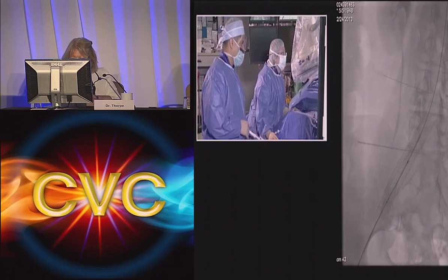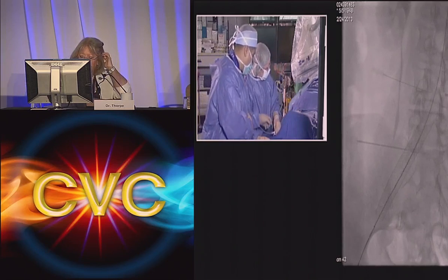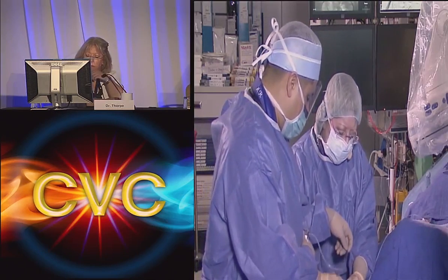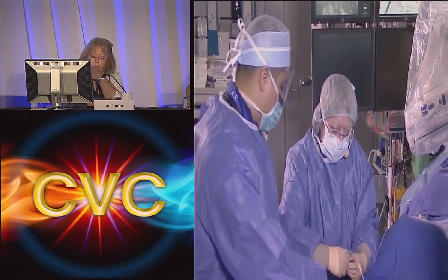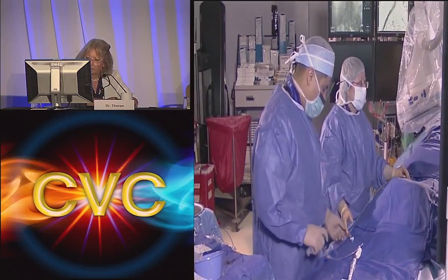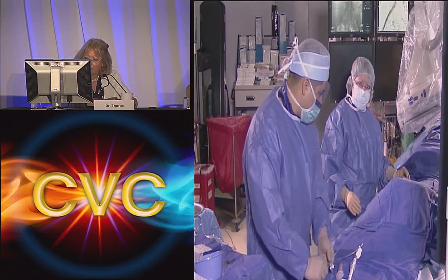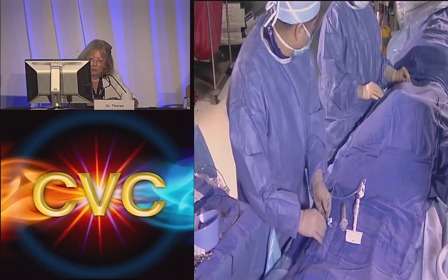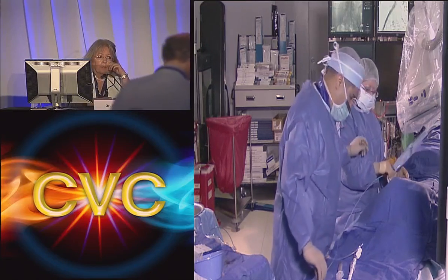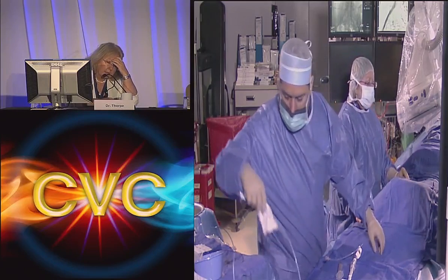All right, and then we'll go back with IVUS. Okay, we'll take that out. Take this off. Makes it easier. Okay, balloon is going to come out. And we'll do an exchange for our IVUS. On the top of the wall stent, you can catch a non-compliant balloon. If you're not careful, it can pop the balloon.